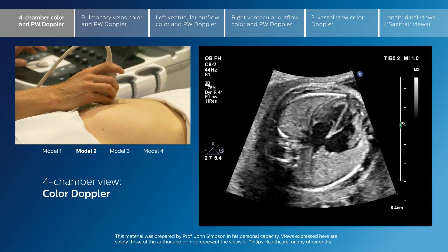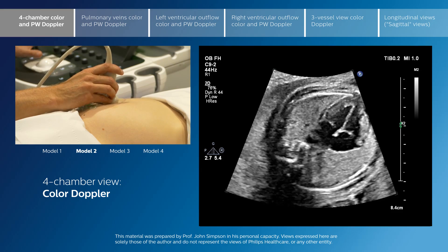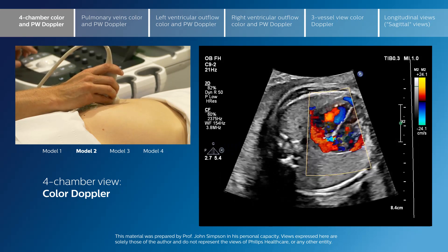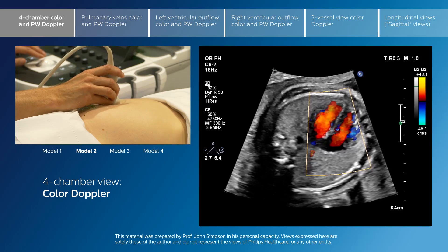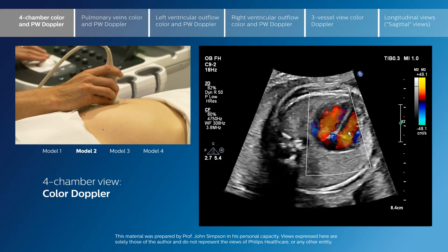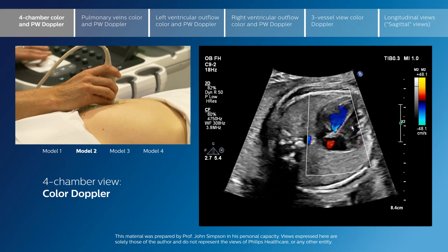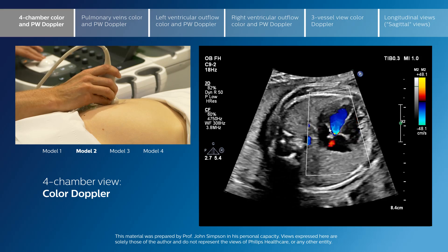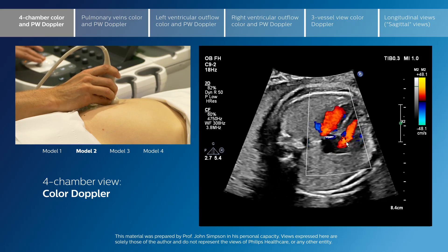Here I've gone back to the four-chamber view and we're seeing the symmetrical size of the left and right ventricles, the opening of the tricuspid valve, and the flow into both the right and left ventricles. On the right we see unaliased flow in a broad jet from the right atrium to the right ventricle and from the left atrium to the left ventricle. We nicely see that there is nothing crossing the ventricular septum, and on these views there is no evidence on colour flow of regurgitation of either the mitral or the tricuspid valve.